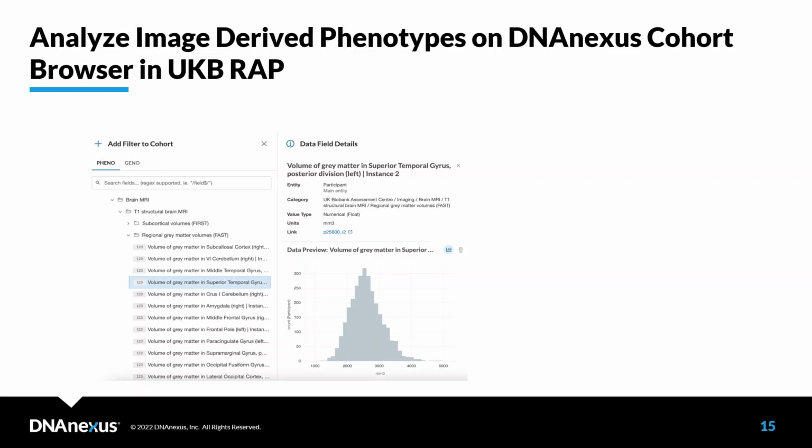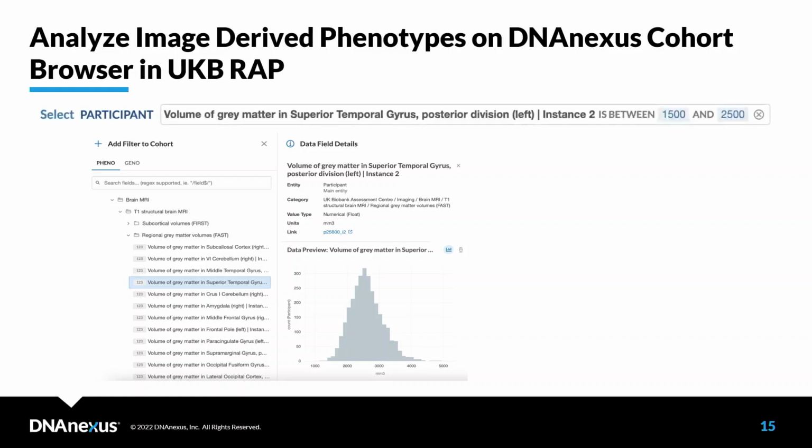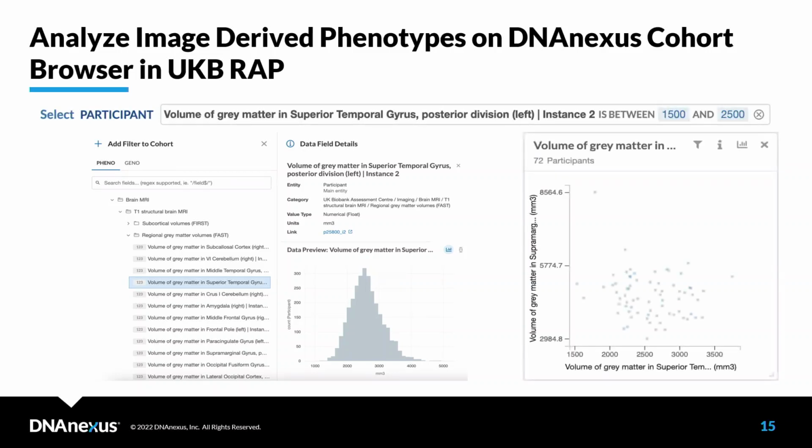And so for each image, we have a set of features, a large number of features to be then used in my machine learning experiments, or let's say GWAS, if you are interested in genomic space, if you are a genomics or bioinformatics scientist. And here, I just used a graphical interface, which is called the cohort browser, to apply some filters in order to specify my cohorts. So yes, in this case, I am focusing on data from FreeSurfer and FSL, considering some volumes and features related to white and gray matter. So yeah, I can here apply simple filters. So this led to specifying my cohort.